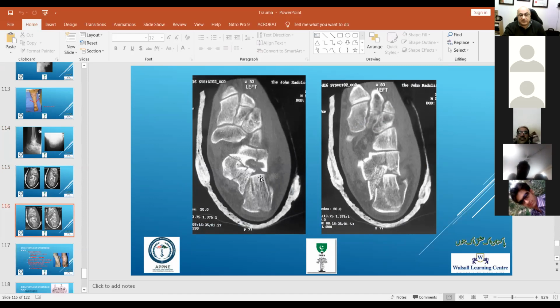You can see an articular surface. It is not displaced, sir. It is not, but you can see the articular surface here. Can you see this line? Yes, sir. That's come from somewhere else, isn't it? So you can see it's foreshortened, and the articular surface somewhere is not where it should be. Although most of it is okay, which means you need relatively little fixation, it does need fixation. If you were going to fix this, how would you fix this?